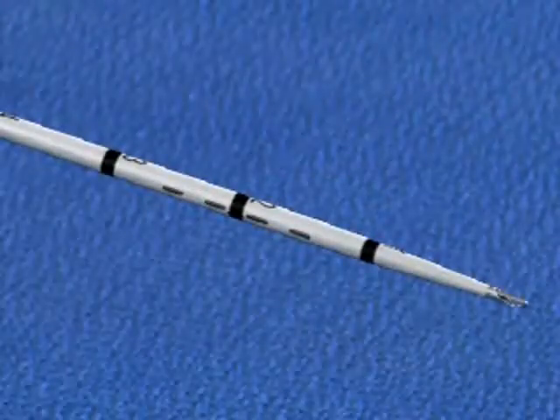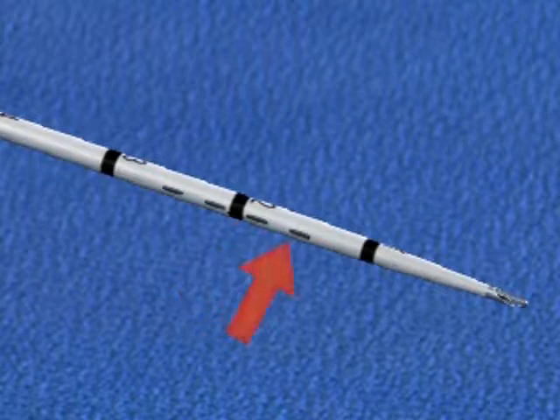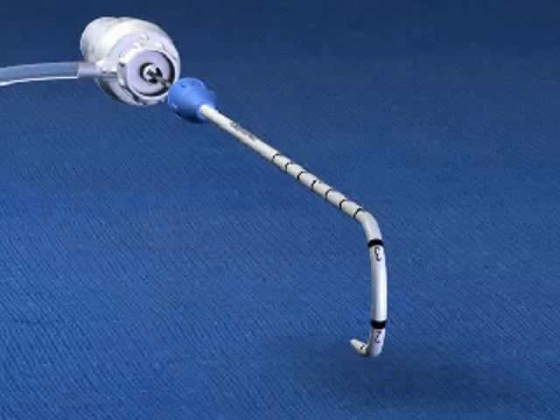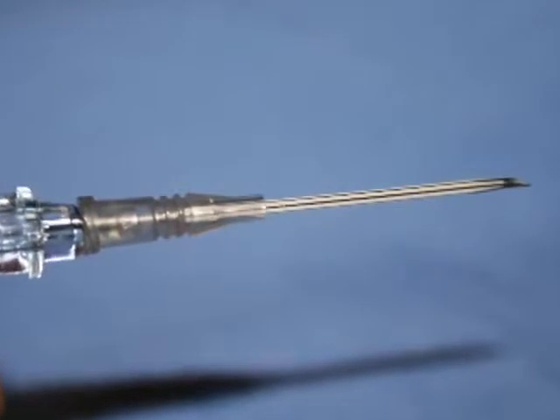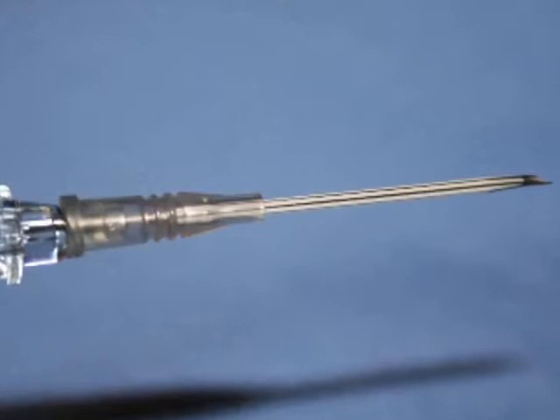Additional advantages of paracentesis-specific devices include multiple distal drainage holes, which facilitate rapid fluid removal, and a pigtail mechanism that curves the distal end of the catheter away from intra-abdominal structures during advancement. If such devices are not available at your institution, standard 18-gauge intravenous catheters may be used. The technique described in the following section is applicable to all over-the-needle catheters.